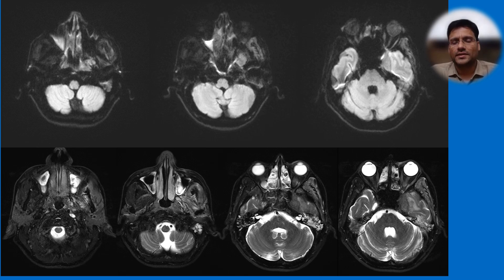Hi, hello, welcome back. Let us discuss an interesting case of an elderly male who presented with visual loss. An MRI brain was ordered to evaluate the cause of his vision loss. The upper row images are diffusion-weighted, the lower row images are T2-weighted. Please write down your findings — the visual loss was on the left side.